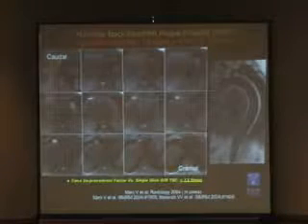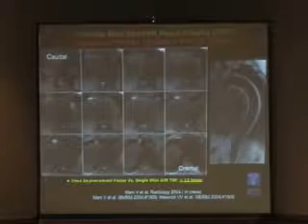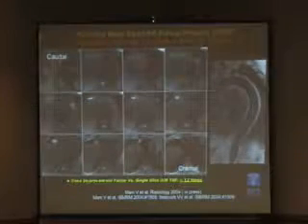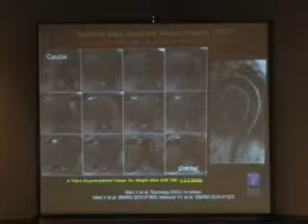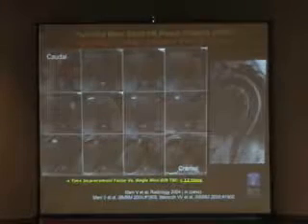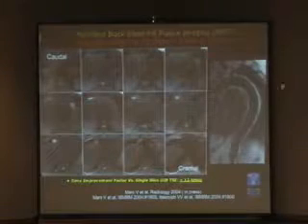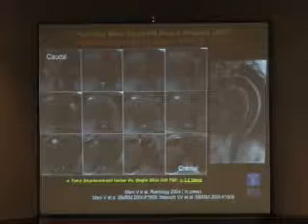I'll just make a little comment here on time, because one of the things that is always mentioned is, oh, MRI takes a lot of time to do, which is actually not true. We're not talking about looking at cardiac function here, where you have to do this over the cardiac cycle and average over multiple cardiac cycles, and it takes more than 20 minutes to an hour to do this exam. I'm showing you here an example of covering from the top, the subclavian, all the way down the aorta in a longitudinal axis. This is something that's obtained in less than a minute.